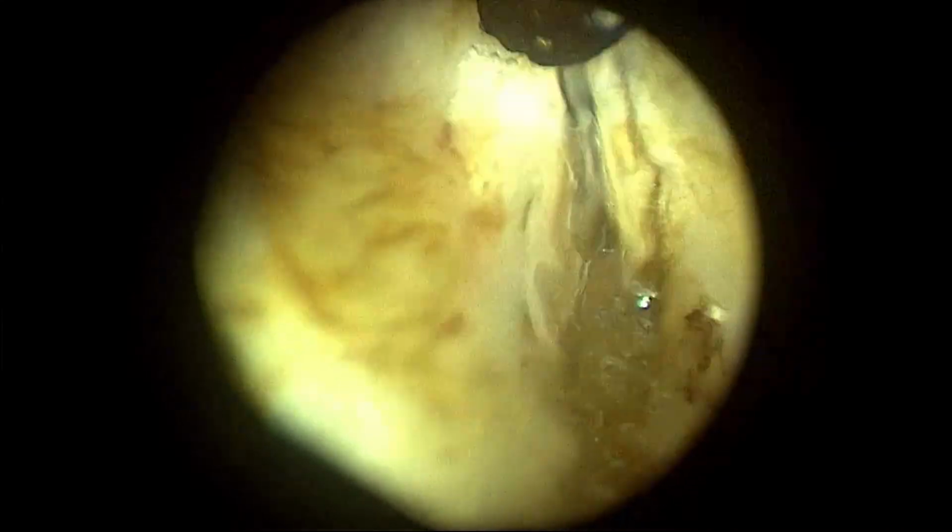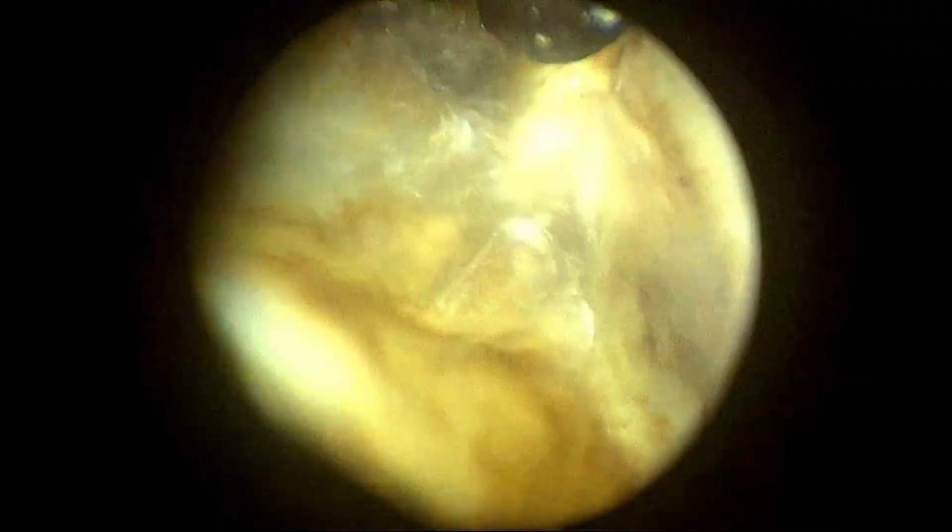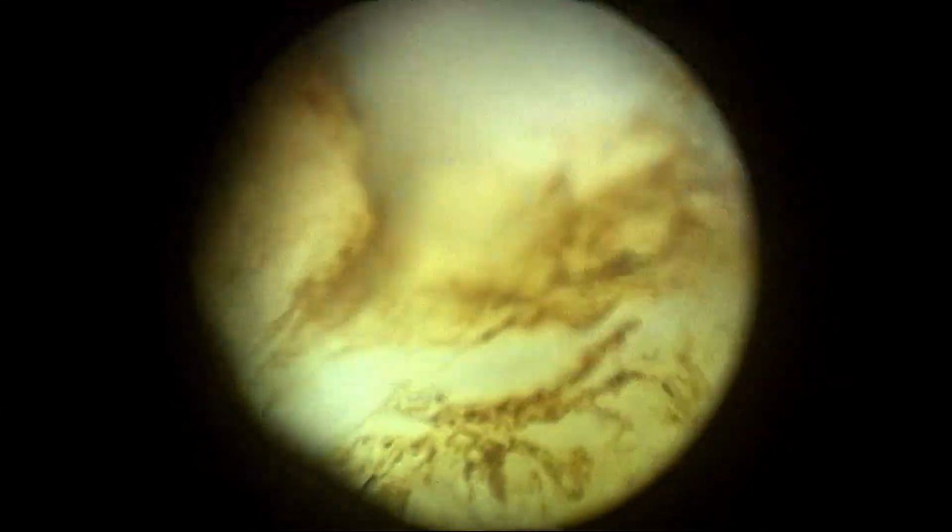Sir, if we are inadvertently in the wrong plane and there's a perforation, a large enough perforation, how do you go about that, sir? If there is a marginal perforation, then you can do a suprapubic diversion, and you can continue. Otherwise, you have to come back. Right, sir.